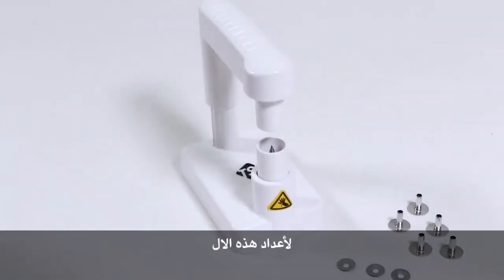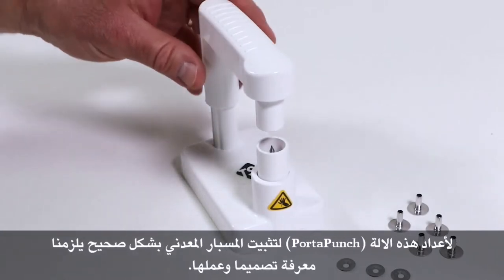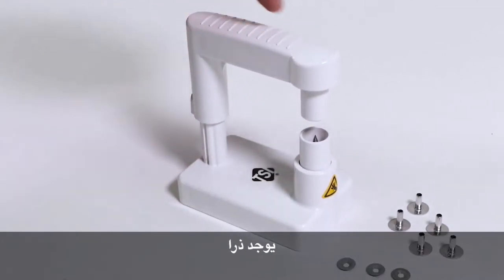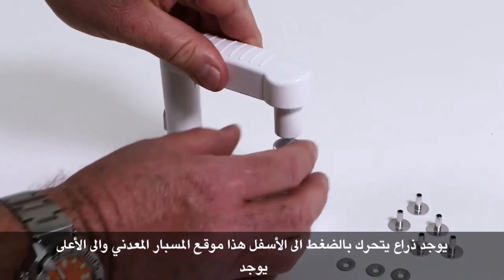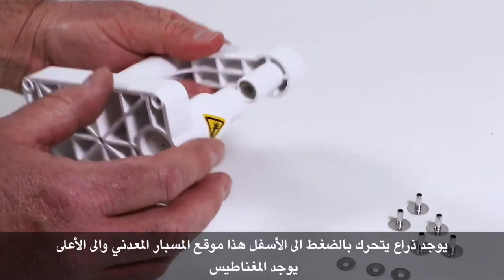To properly set up a Porta Punch to probe a filtering facepiece respirator, let's first look at the design of the Porta Punch. We have a lever arm which pushes down, there's the probing tool here, and there's the magnet up here.